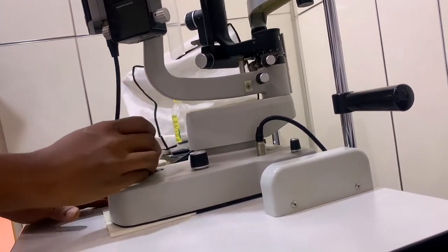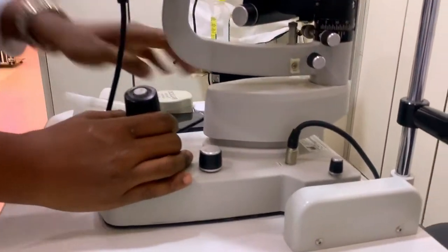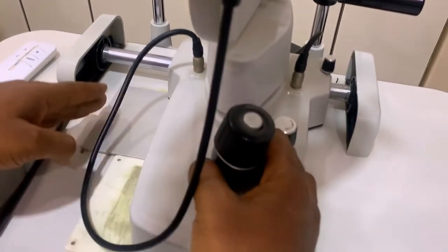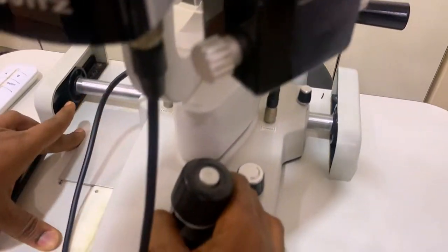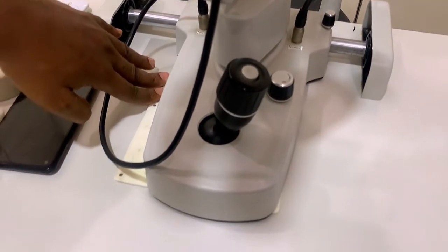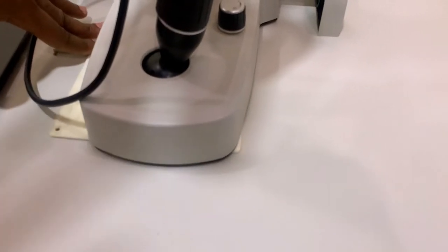After the joystick, the next thing is the gliding plate. Please come and see the gliding plate. This is what prevents friction of this instrument. It allows free movement of the slit lamp biomicroscope without any jerking. It's because of this gliding plate that you don't hear any jacking sounds on the instrument.